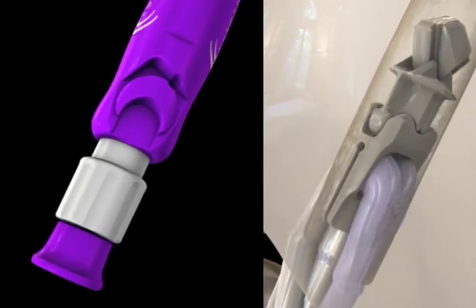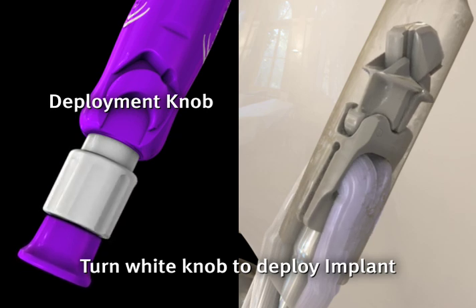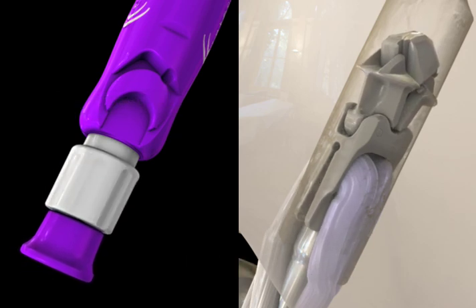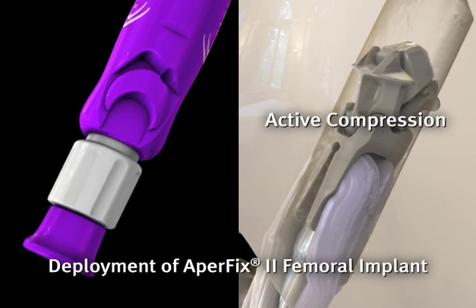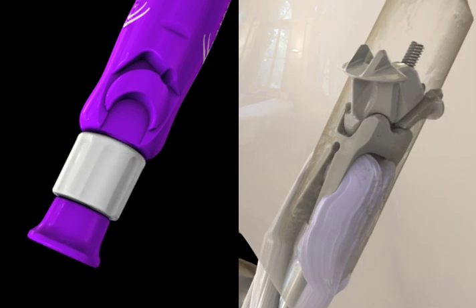With the pin removed, the white deployment knob is turned in a clockwise direction until it comes into contact with the purple inserter handle. As the implant is deployed, the fixation of the femoral implant is taking place and the grafts are actively compressed against the tunnel wall at the aperture.